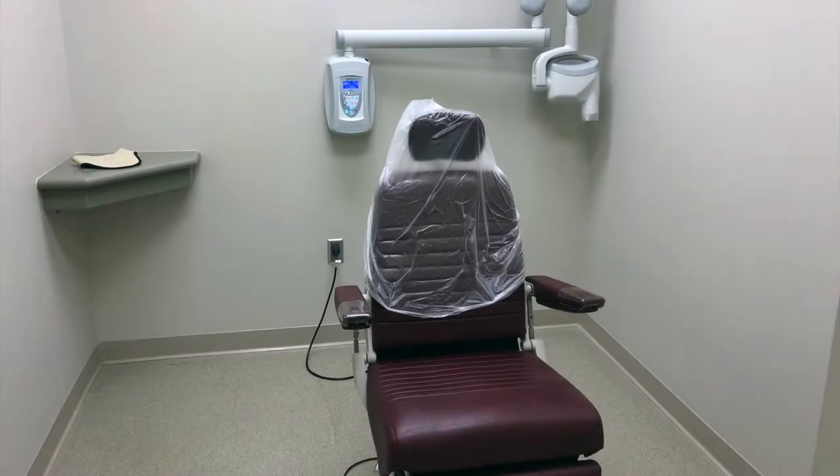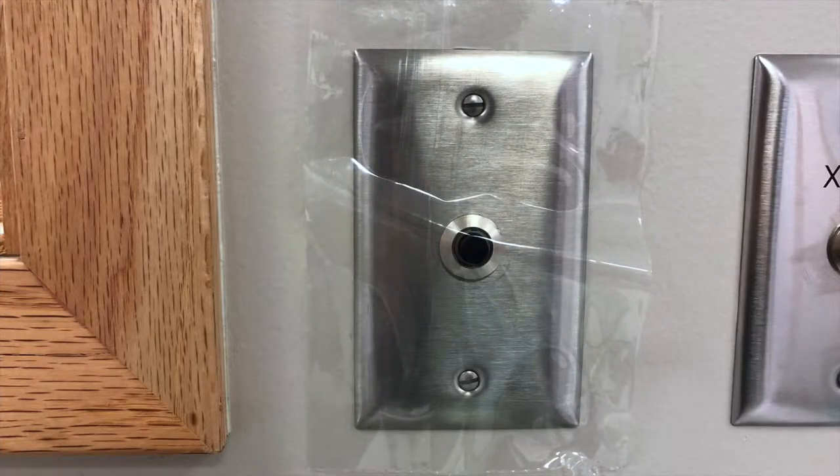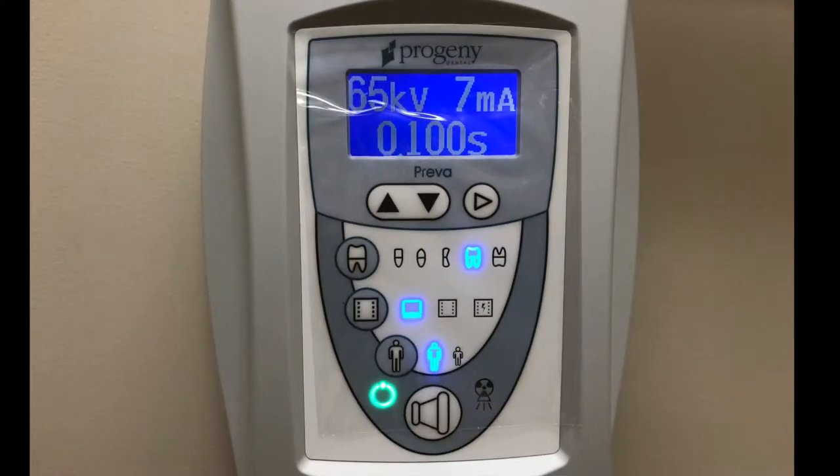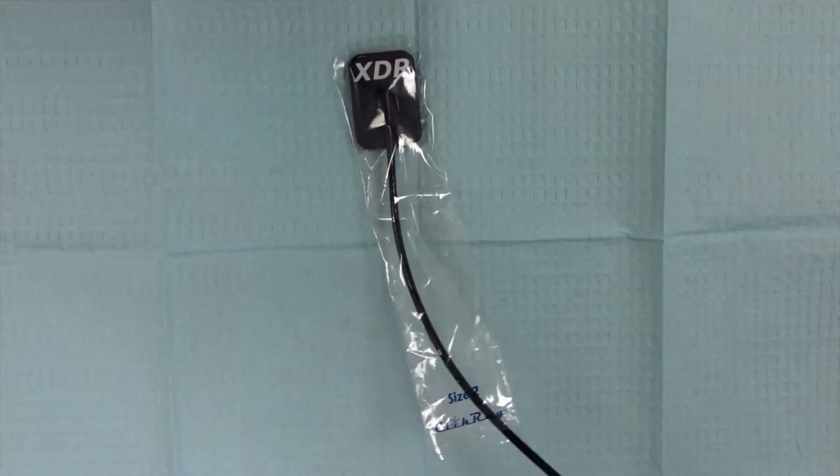First, you must cover the appropriate areas with plastic. The patient's chair must be bagged. The mouse of the computer, exposure button, and control panel on the x-ray machine must be covered with a plastic barrier, and the sensor size should be chosen and covered with the size-appropriate plastic sleeve.